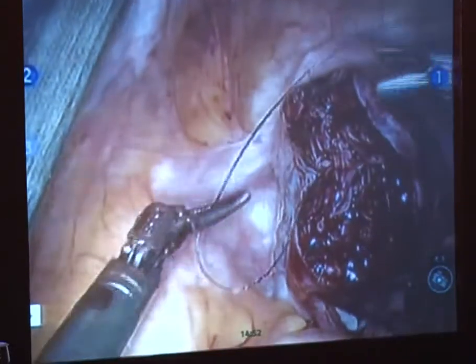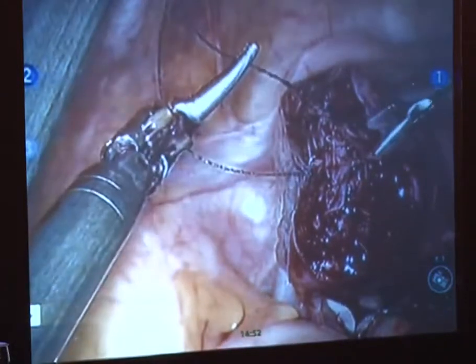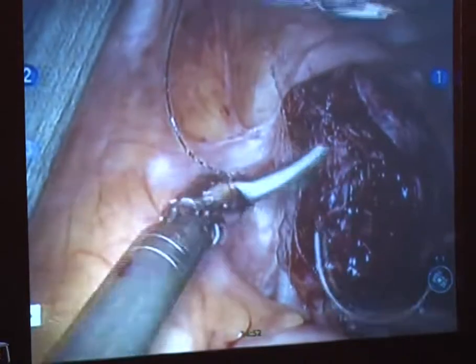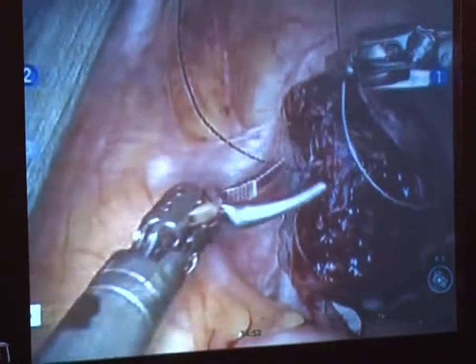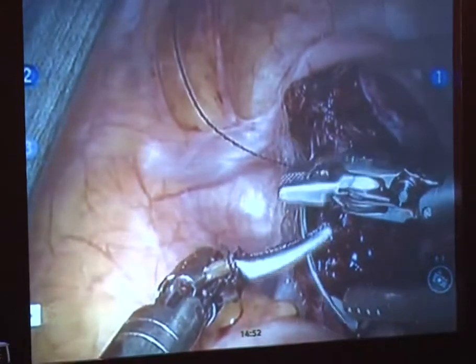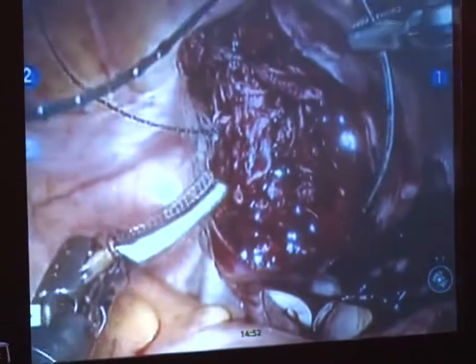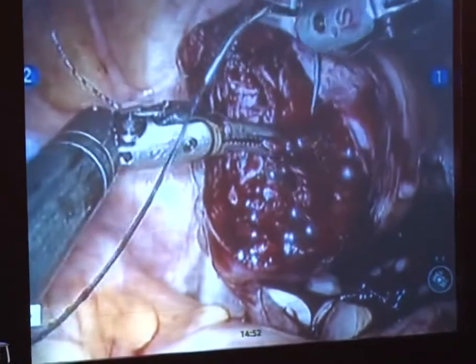Is she at risk for rupture? Absolutely. It's about 1-2% in the literature for myomectomy. So transverse or vertical incision doesn't make any difference. Maybe it's a little bit higher with the fact that we did make a somewhat vertical incision, but at the same time it was necessary in her particular case to do so.